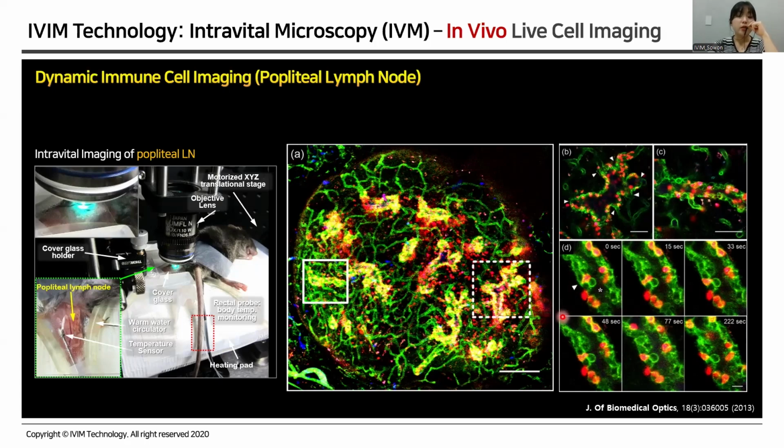Specialized vessels that mediate lymphocytes' entry into the lymph node. After intravenously transferring T cells, we observed them entering the HEVs through multiple entrances connected to capillaries. You can see the T cell adhering to the endothelial cells and exhibiting prolonged rolling behavior, which is critical for their migration into the lymph node.